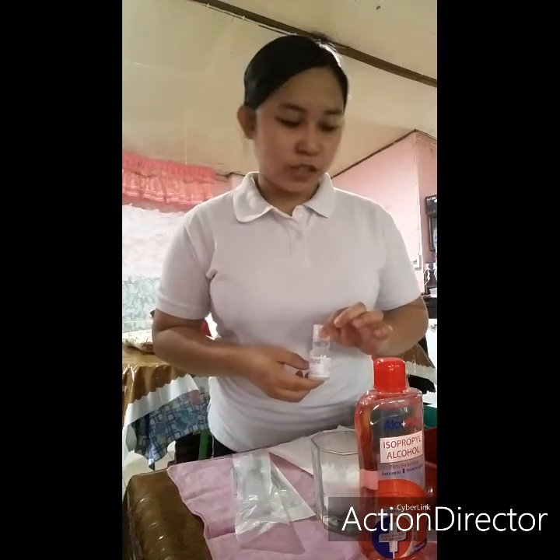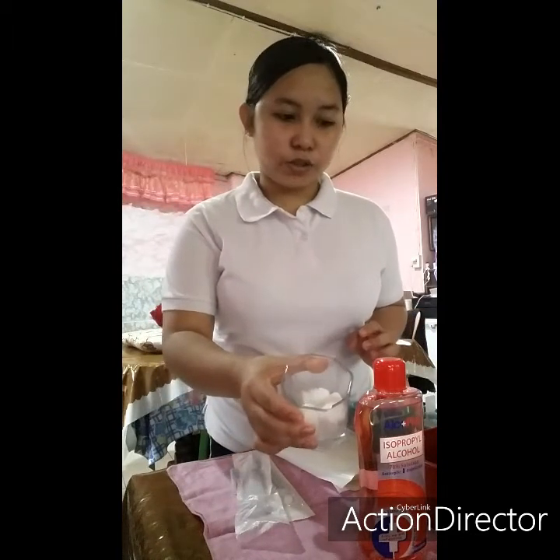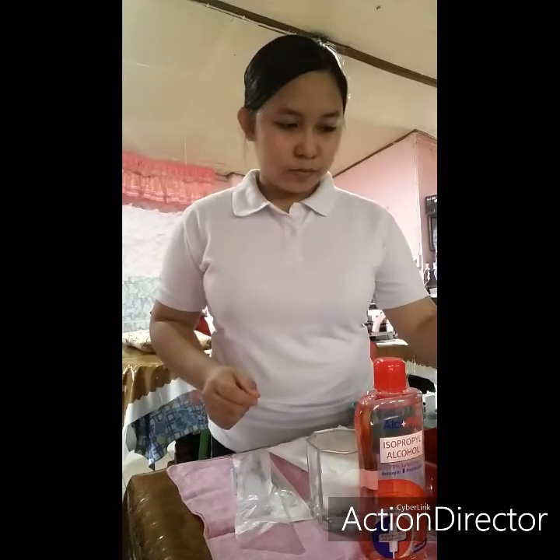So I have the equipment prepared here. I have syringes, gloves, sterile water used as the medication in this demonstration, forceps, kidney basin, cotton balls with antiseptic 70% alcohol solution, then a trash bin for sharps and other hazardous materials that we use for this demonstration.